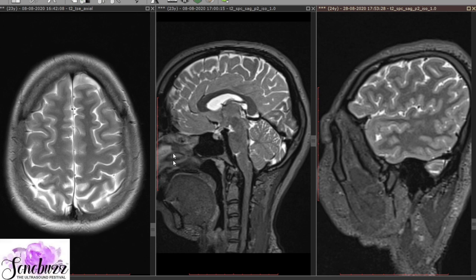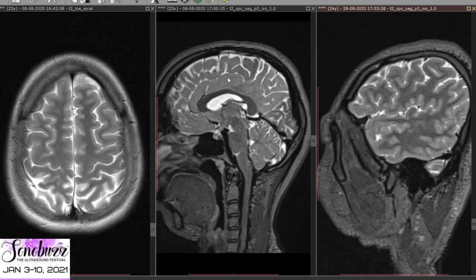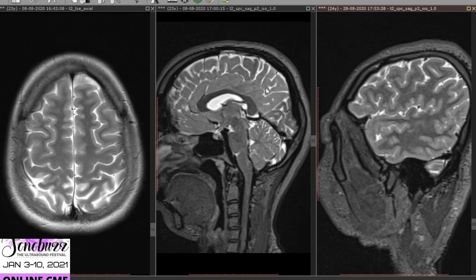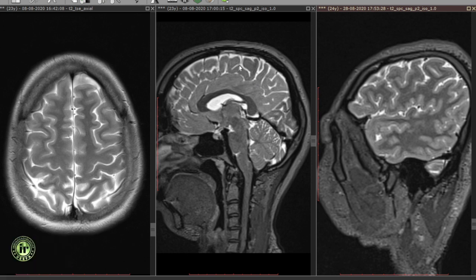Let us start by having a look at the cerebral hemispheres. The cerebral hemispheres lie above the tentorium cerebelli and are conventionally divided into the frontal, parietal, occipital and temporal lobes by the various sulci and fissures.